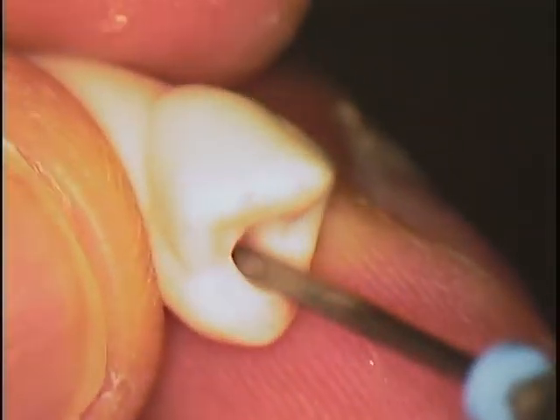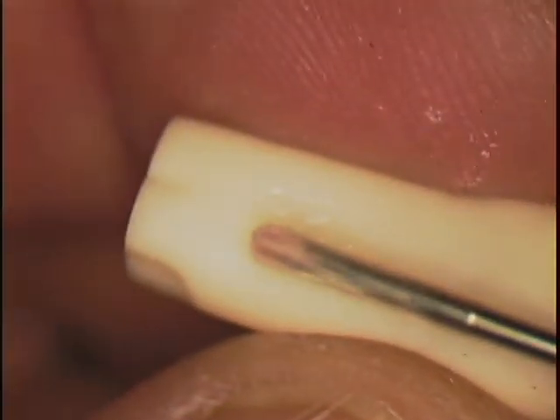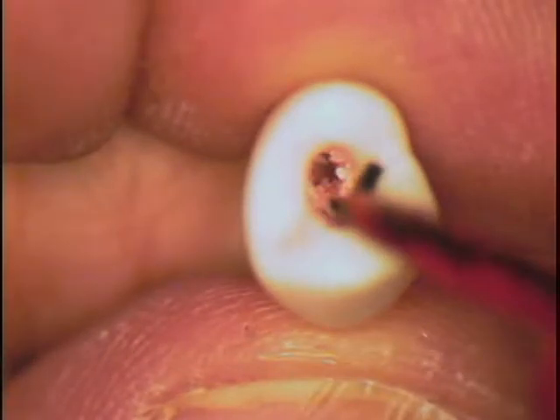If you can't find a red one out there, I think we have some that are not color coded, but the diameter is right, so we can measure that for you. Okay. And here we go. So I'm going to go ahead in my lingual canal. Feel it binding a little bit. Make sure I'm going about 2/3. Right about there. Again, I'm going to lubricate. A lot of debris in there.